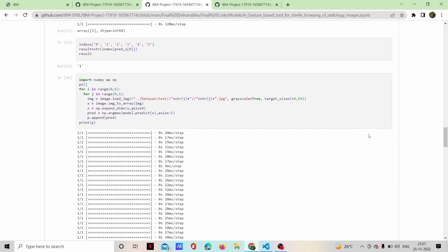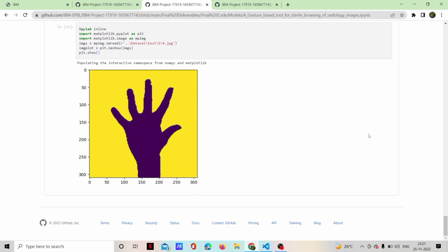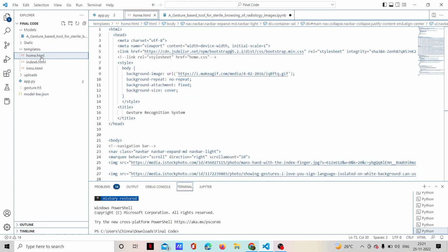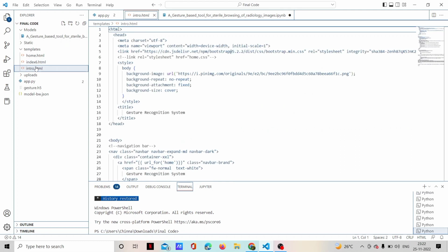Next we move on to application building. First we created 3 HTML pages. The home page, the main page. So this is the code for the home page. Next is the introduction page. The introduction page just gives a gist of what our page is about. And then finally the launch page where we predict the results.